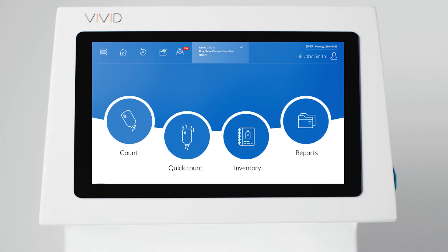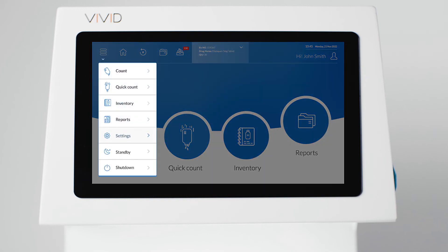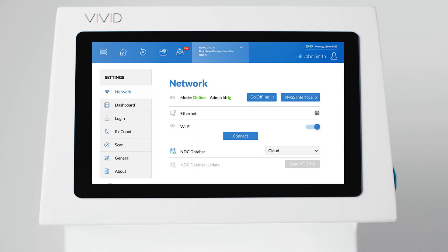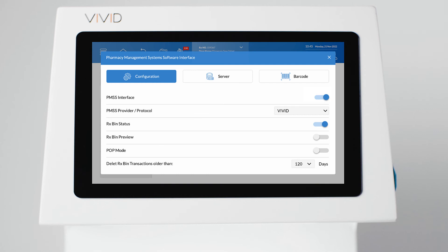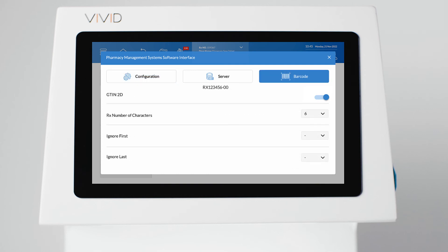Now, let's configure your barcode. Press Menu and select Settings. Select the Network tab and press the Interface button. Press on the Barcode tab and scan the transaction barcode that contains the Rx number. Your barcode may have additional characters such as a letter in the front or a dash with the fill number at the end — those need to be ignored. For example, if the scanned barcode is Rx123456-00 and the Rx number is 123456, you will have to set the Rx number of characters to 6, ignoring the first two characters and the last three.